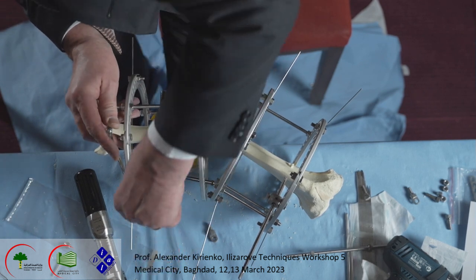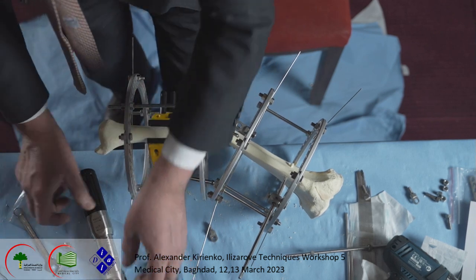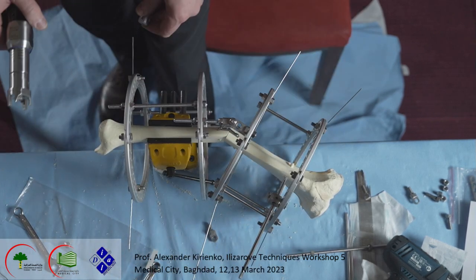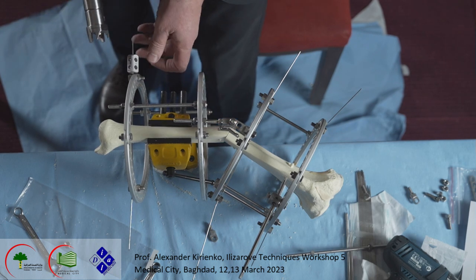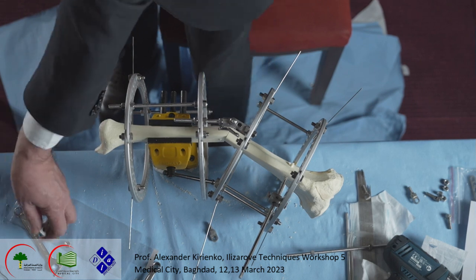I tied this. Good. Tension from this side immediately.